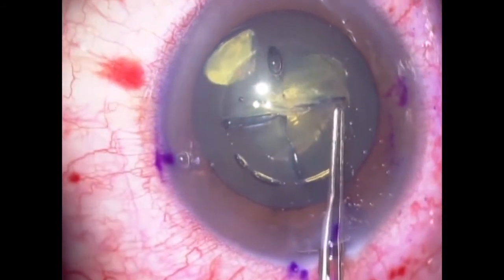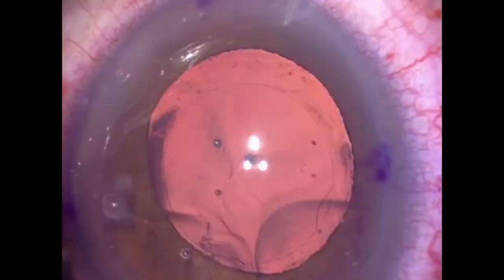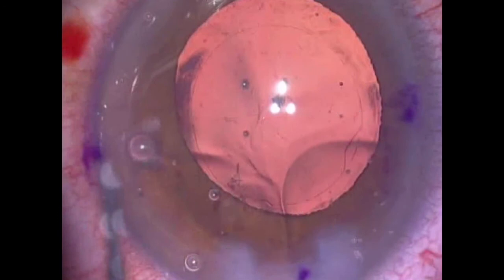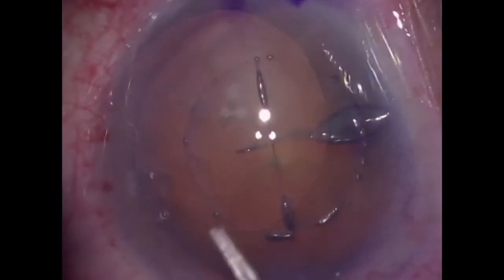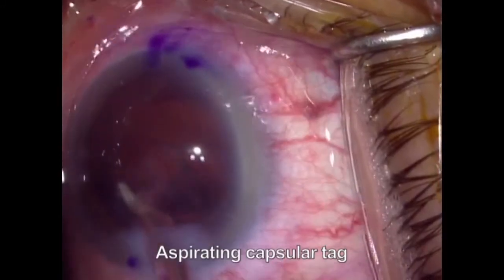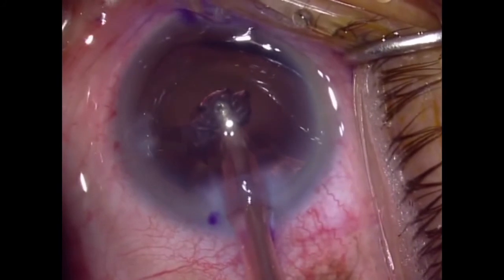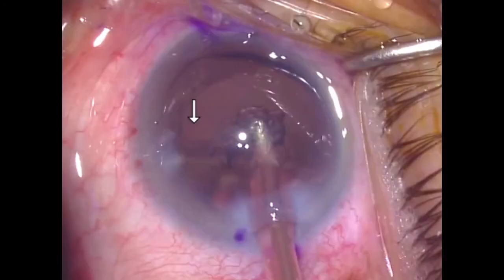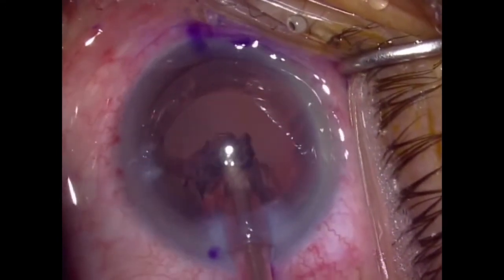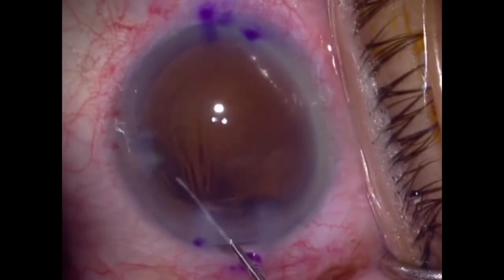Potentially much more dangerous are the tags and irregular CCC edges that used to be common. Here we see a residual capsular tag and bridge. Another case of incomplete femto CCC, except that a capsular tag was not seen in this case and the IA cannula aspirated a tag which extended into a large crescent of anterior capsular rim. If this had not been appreciated and IA continued, a rip in the posterior capsule would have likely resulted.